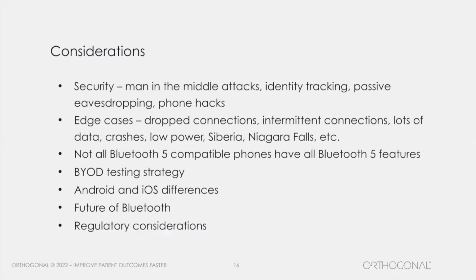There's a whole bunch of those, and I think we're going to be dealing with those edge cases in another webinar. At a high level, we list those out, and we have various ways of testing for those edge cases as part of our verification processes, and then platform compatibility testing.